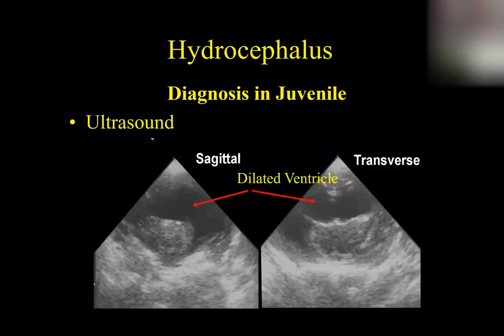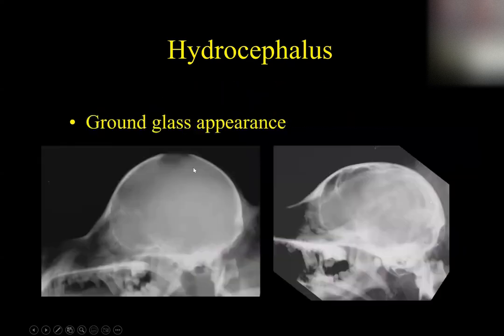Okay. This is an ultrasound. If you have a dog that looks like this, that has a big open fontanelle with no bone there, that's your window to the brain with an ultrasound probe. You can set an ultrasound probe right on that part of the open fontanelle, and you can peer into the brain with ultrasound. If they have bone there, ultrasound won't penetrate through bone and that won't work.